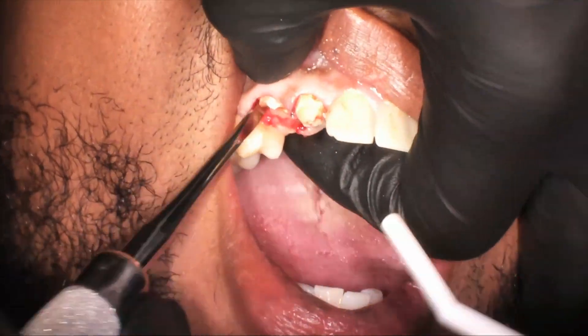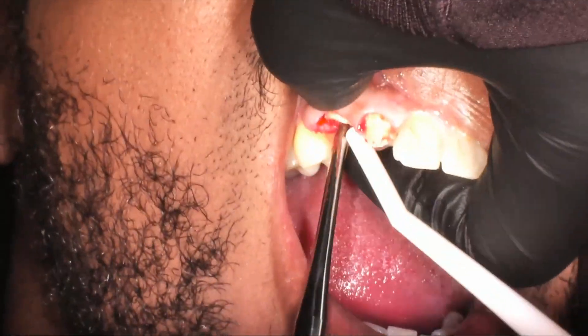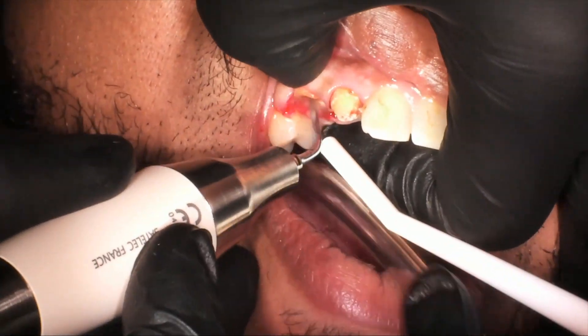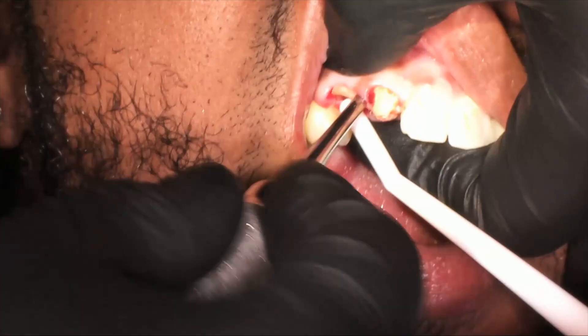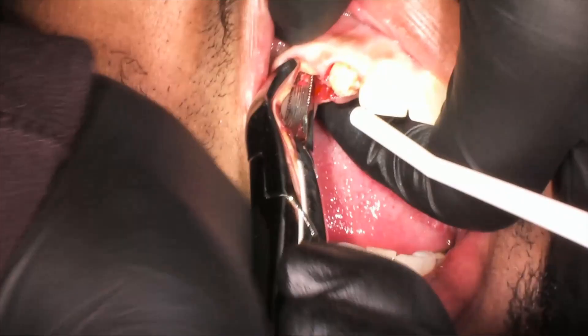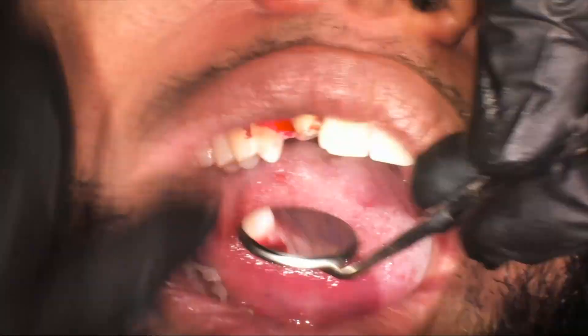We loosen it, grab it with the forceps, still struggling, and break it off. Coming back in with elevators — at this point it's about having patience. I want to section the area and get it out, but I don't want to lose that valuable buccal bone because the patient wants to do an implant. We try to grab with forceps again, and once we get it loose, we're able to get it out.